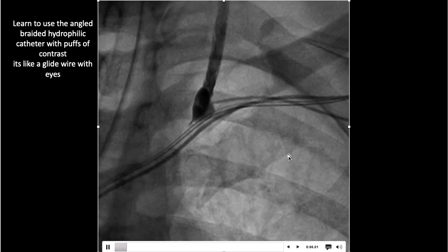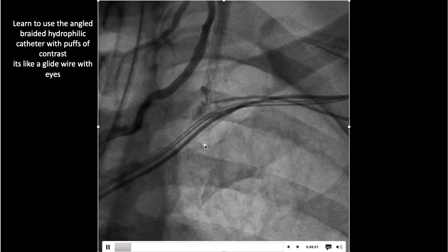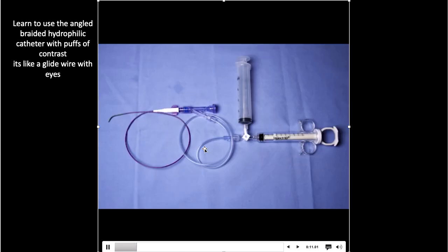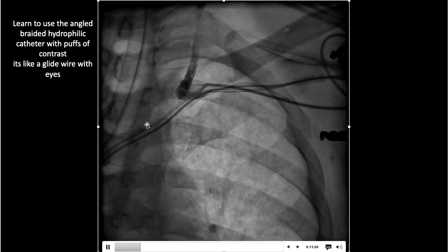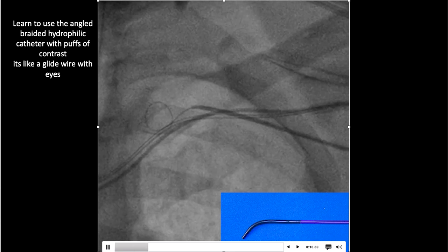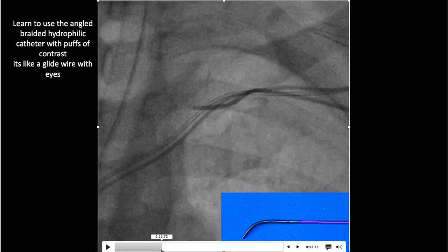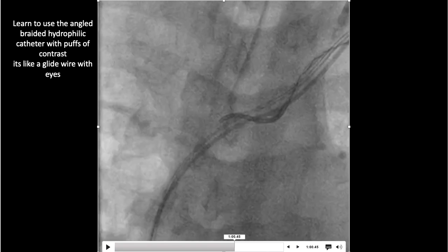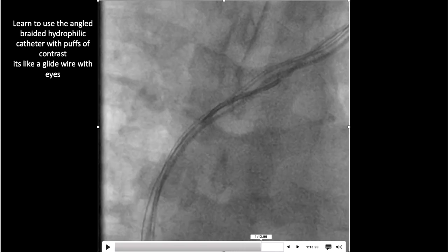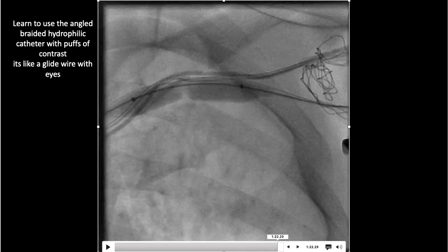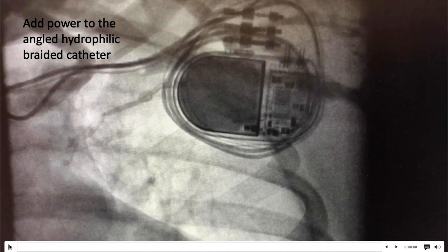Another example of using the angled hydrophilic catheter to cross an occlusion: we get our wire in, have our microcatheter take a picture, realize it's going to be tight, get out our angled hydrophilic catheter, and use it to cross the occlusion — driving it along until we reach the innominate-SVC junction, then advancing the glide wire and coming back to perform venoplasty.